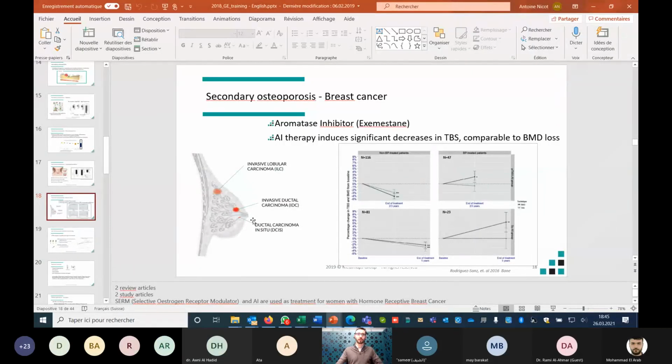This slide illustrates what I was talking about earlier with aromatase inhibitors. As you can see, the difference. Both of these treatments, we know, have a negative impact on bone health through breast cancer. In this graph, in patients without any treatment, both bone density and TBS go down. But in some patients with a bisphosphonate, you can see that as BMD goes up, you have a maintenance of your TBS. What is interesting is to see the structure of the bone and whether this maintenance doesn't become, in some patients, a degradation of the structure. Thus again the idea of what the impact is on my patients and whether, for some of them, I should adjust to a different type of treatment.